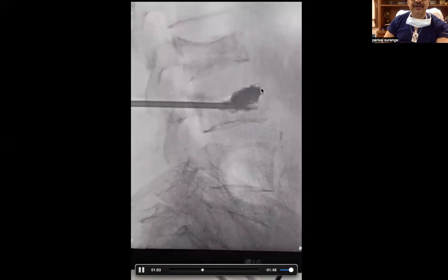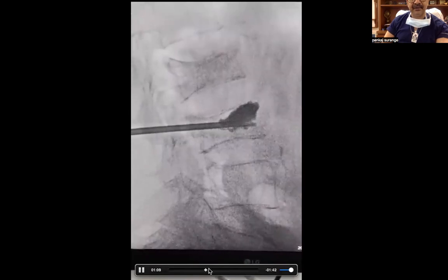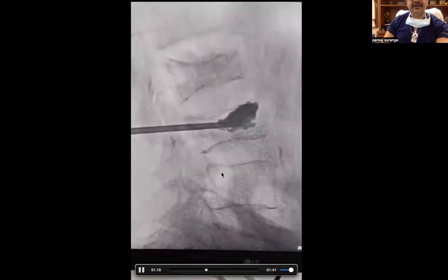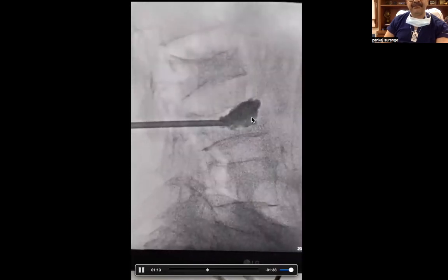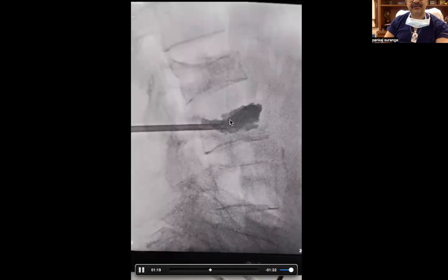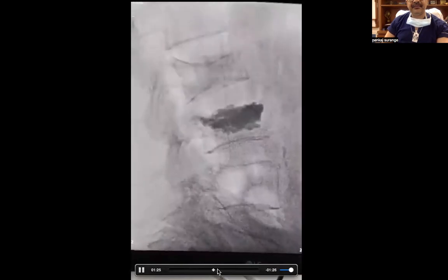You have to carefully watch the anterior border of the vertebral body. The cement should not leak from the anterior body. And you can see here now, this portion I nearly filled. Now it's started coming back. We started filling the remaining cleft. Now you can see this AP view. This is where the cleft was. You saw in the MRI, it is completely filled, and the rest of this body is active. We don't want to disturb this part. We just wanted to fill the cleft over here, and that is what we did.